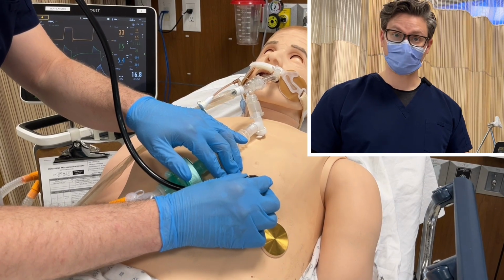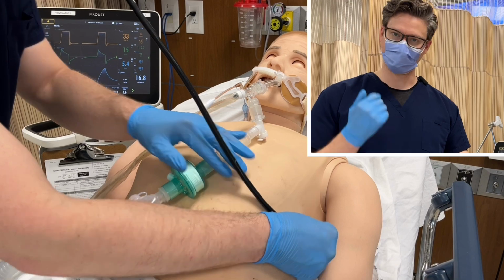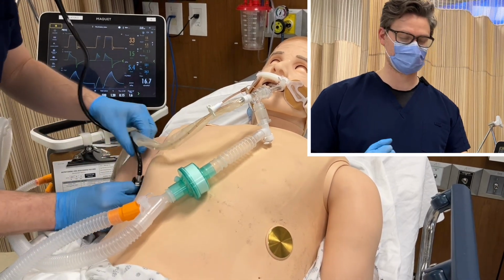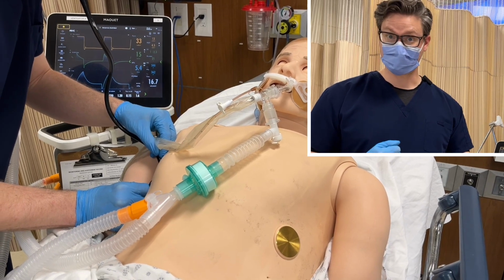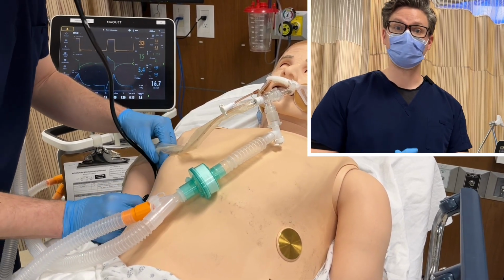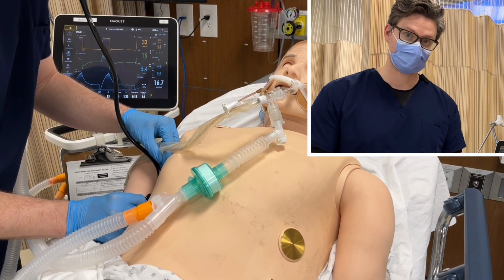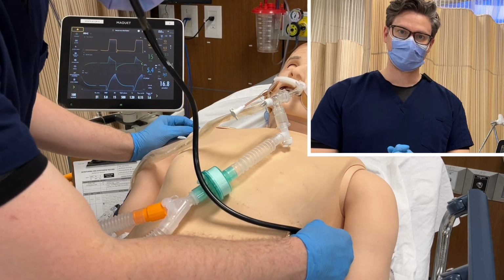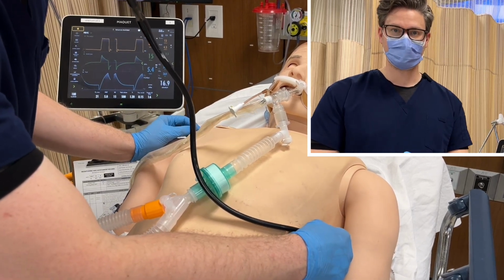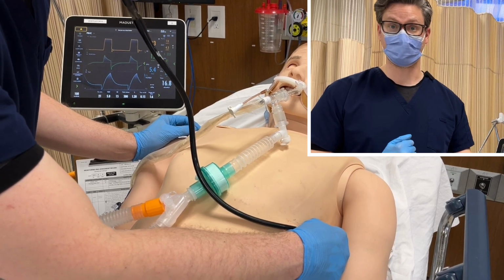When we suction our patient, we should take note of the amount of the secretions, the thickness or tenacity of the secretions, and the color of the secretion. After we perform our suction, we should re-listen to the patient to see if we hear any improvements to their lung sounds. If we think we need to do another pass of the suction, we'll perform another suction and then once again reassess by auscultating to listen to see if any changes were made.